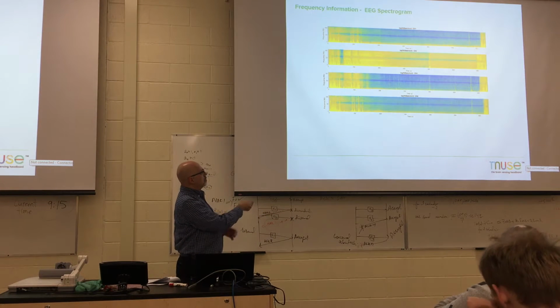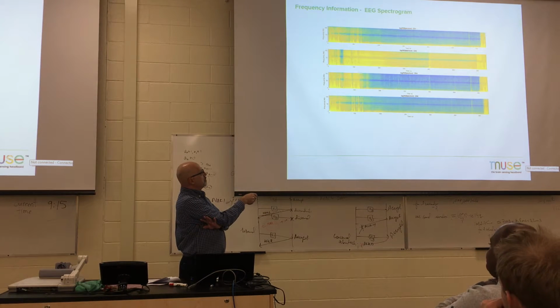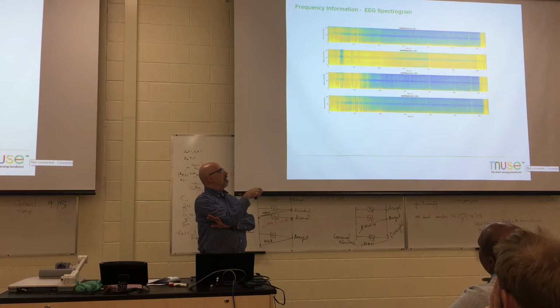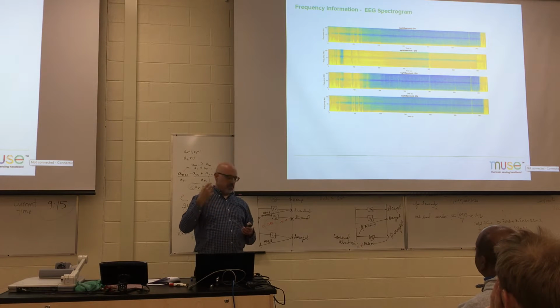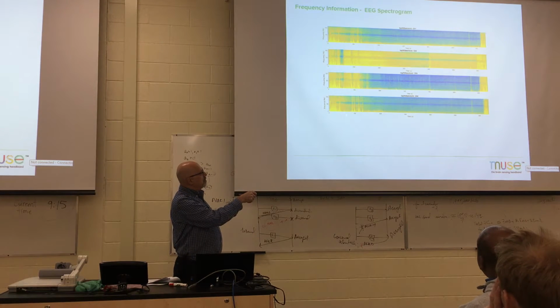All right, so let's start here at 0. This is the first second, and at that first second, this is the power of each frequency component. The y-axis is frequency. So if you pick a pixel here, let's say at 50 hertz, that color represents the power of the frequency component of 50 hertz in that signal at that moment in time. So you can decompose a signal all the way across.